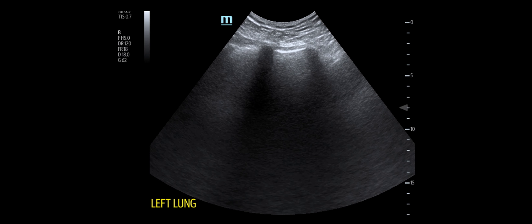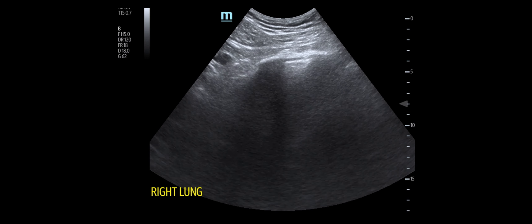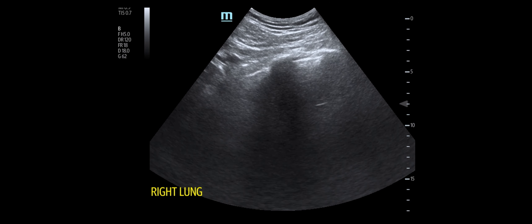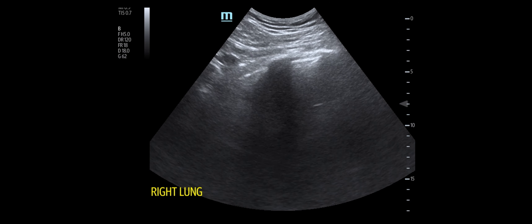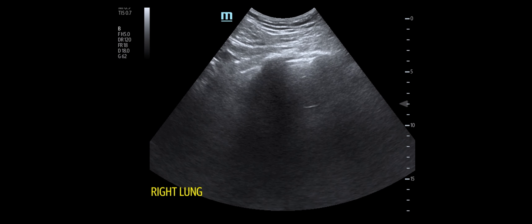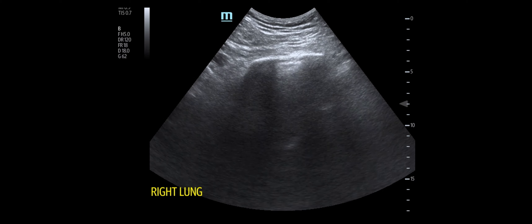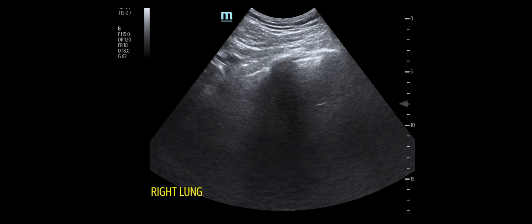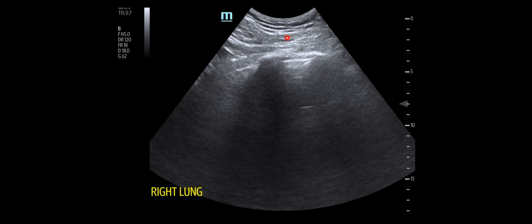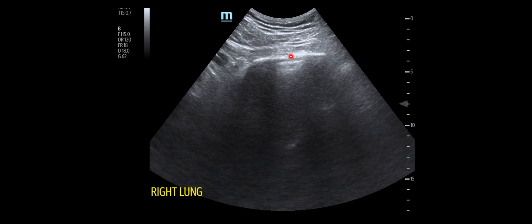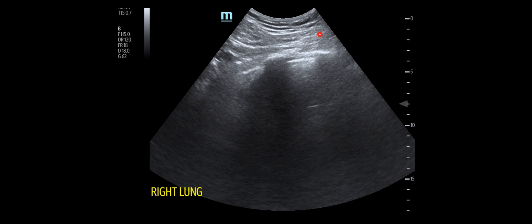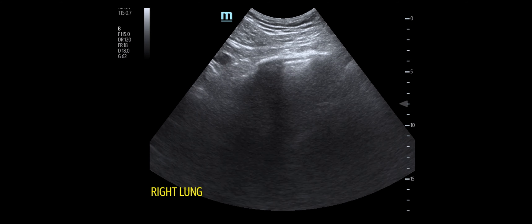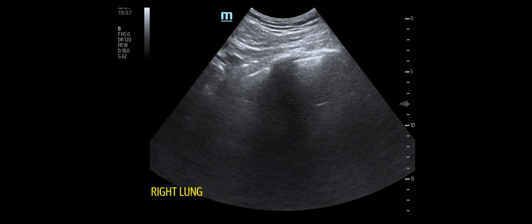Case four is a 34-year-old who presents after a cycling accident, being a little bit tachypneic. A useful technique point: anchor your hand and wrist to the chest wall rather than holding the transducer free. When the patient breathes, you move with them, reducing movement of soft tissues relative to the transducer. In more subtle cases this makes it much easier to see whether you've got lung sliding, letting you focus on that pleural line.